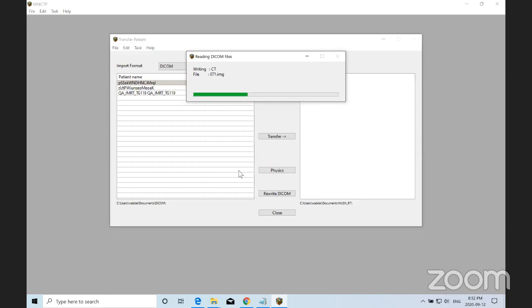Well, yes, because for example for Varian, probably the component model is going to be the jaws, okay? We have a cobalt machine, and the dynamic component models are the jaws. We have two sets of jaws, so we have jaws and trimmers. The question is, how easy can we use that machine with MMCTP? So if the jaws function very similar to how the Varian jaws function, then you can use the same method.